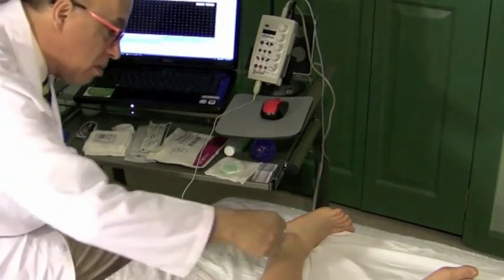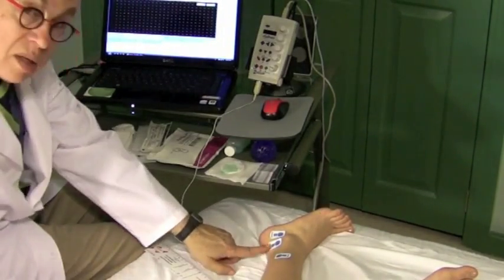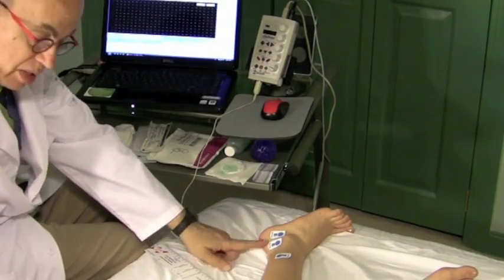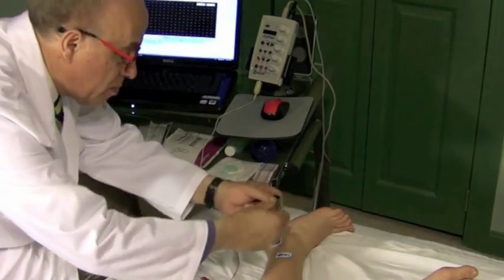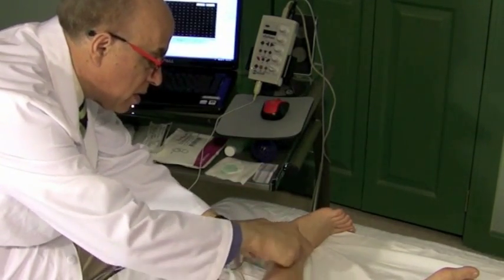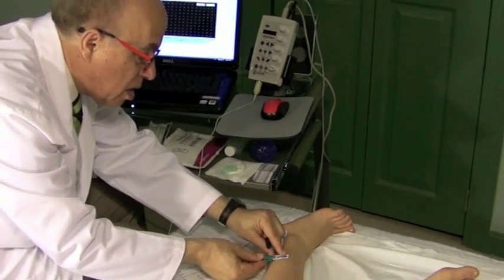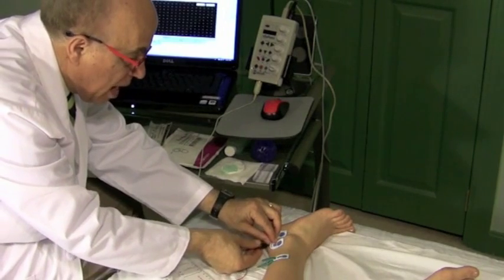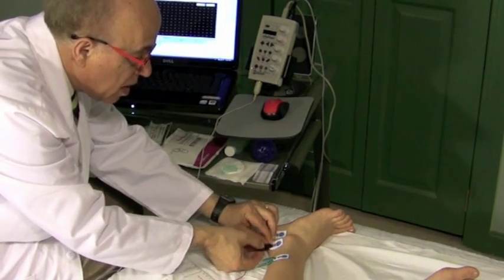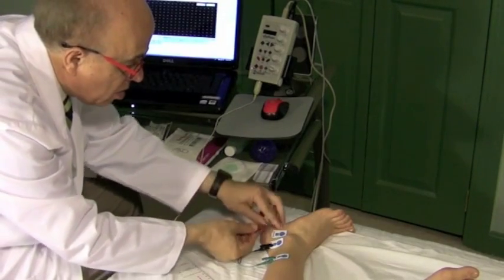And I'm going to put it between the stimulator for the time being and the electrode that's going to be connected to the black or active electrode. So let's connect the green here, like so. Actually, let me reverse that to make it easier. Connect the green, okay, that's the ground. Connect the black, that's the active electrode, and then connect the red, and that's the reference electrode.